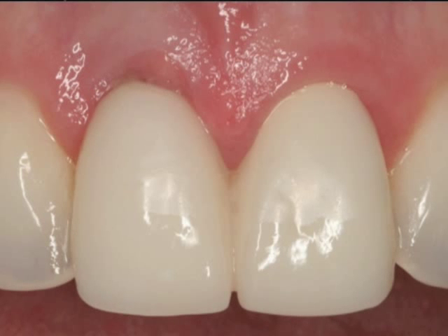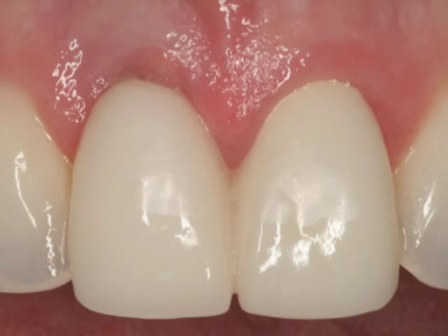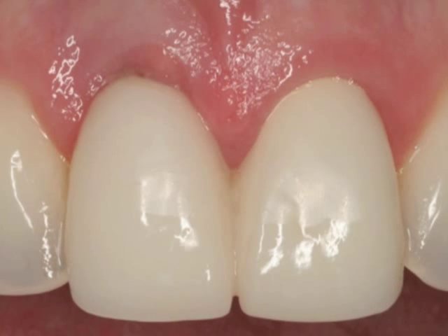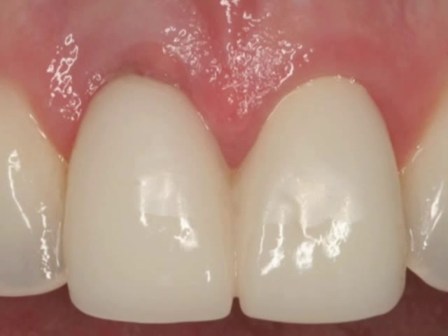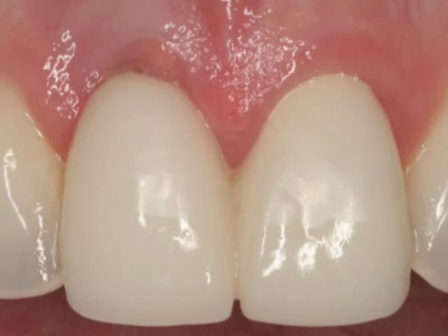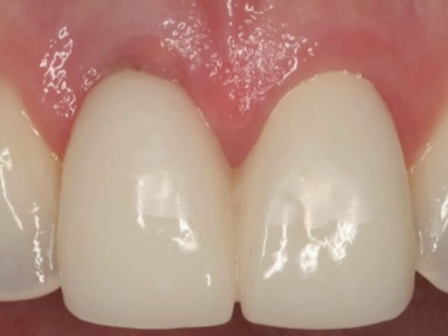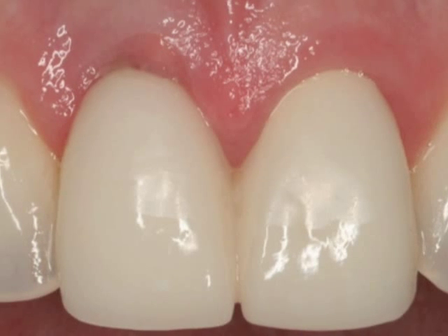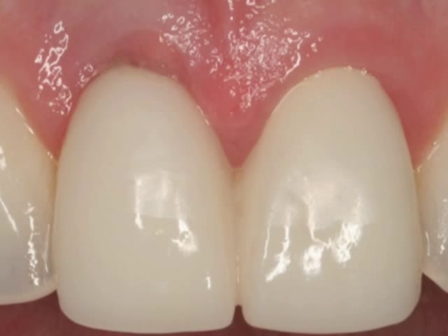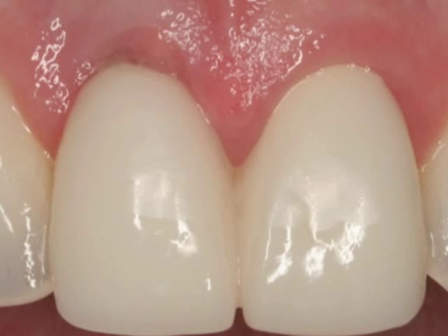And of course, we want it to look like the adjacent tooth gum tissue. So the contours of the temporary restoration we make are specifically identical to the adjacent teeth, and therefore the gum tissue will heal to exactly duplicate the adjacent teeth. And we like to let that set for at least 2 months for 2 reasons. One is to allow the implant and bone interface to grow with each other. And the second reason is to allow that gingival contour that the provisional restoration is forming to fully mature before we take our impressions for our final crowns. So that's why we wait typically 2 months before we proceed with making the final crowns.